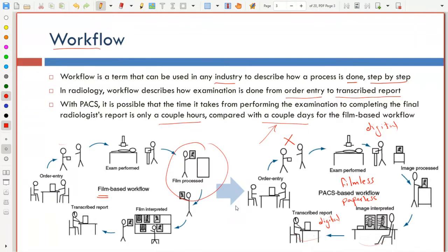And the problem is, whenever you go, instead of waiting for your file to be found, or suffering from your file being lost, now you're faced with a problem that the network is down. So you go every day, for example, and they tell you that the system is down and we cannot do anything for you. So when you have a digital system that defies the purpose, when the problem becomes the digital system not working, then people will reject the solution that you're offering them.